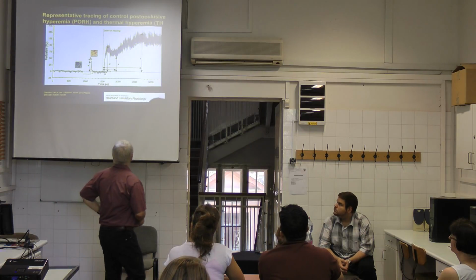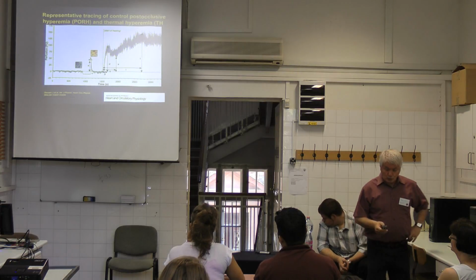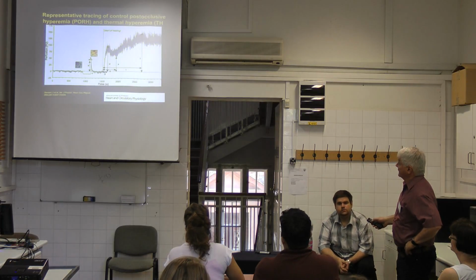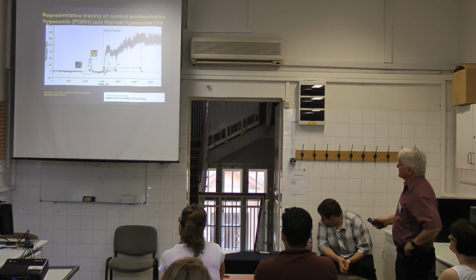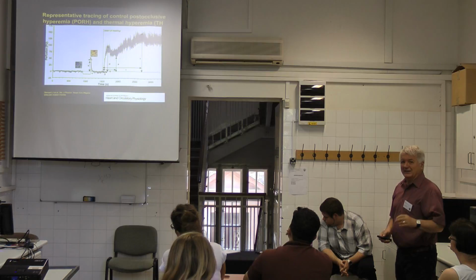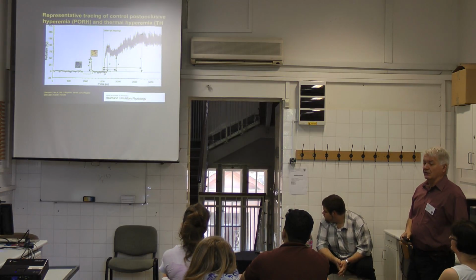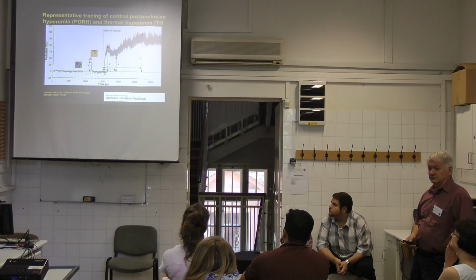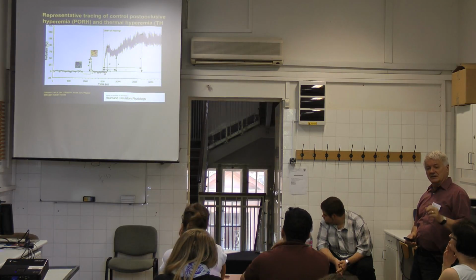So this is a normal provocation again. This is a single point measurement before the stimulation or before the occlusion. It was normal flow. What can you also see in this report? Some dynamics. The flow is not stable. It is somehow changing. Why?